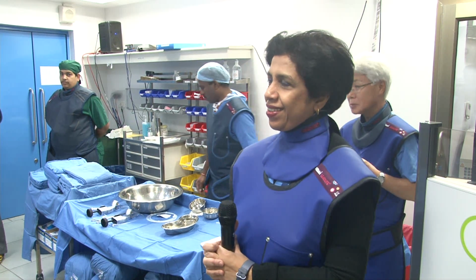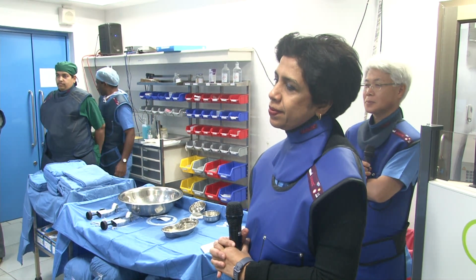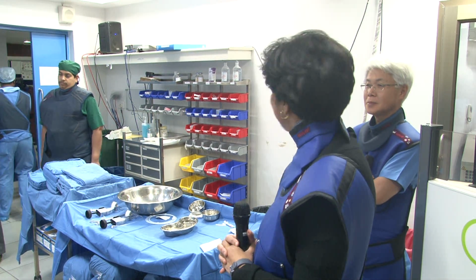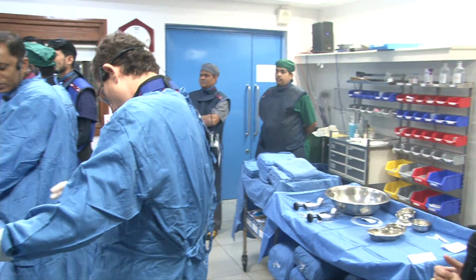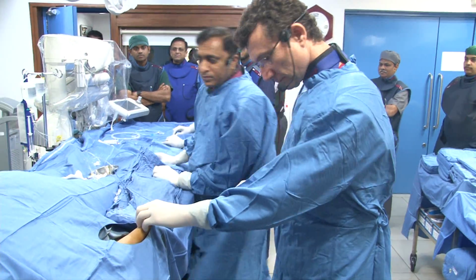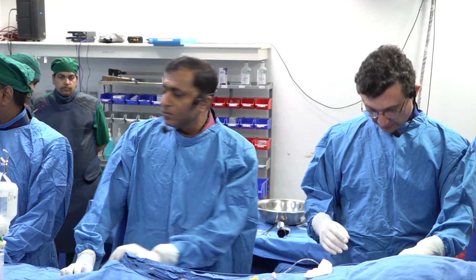Is that the regular routine way of taking catheters up? Yes. Okay, so regular wire, combo technique. Good morning, Mauricio. Can you hear us? Just to make sure that... Where are the pedals? Can you guys hear us? Yes, we can hear you well, Luis. Okay, perfect.